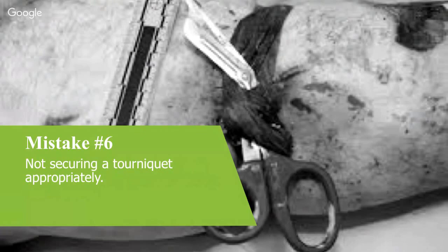So I guess in that setting, Jez, just to jump in, mate, ideally you'd just chuck a second one above it, if you've got the ability to do so. Yeah, if you've got a second one, definitely. All right, anything further, Dan, to add to mistake number 6? No, mate, let's move on.